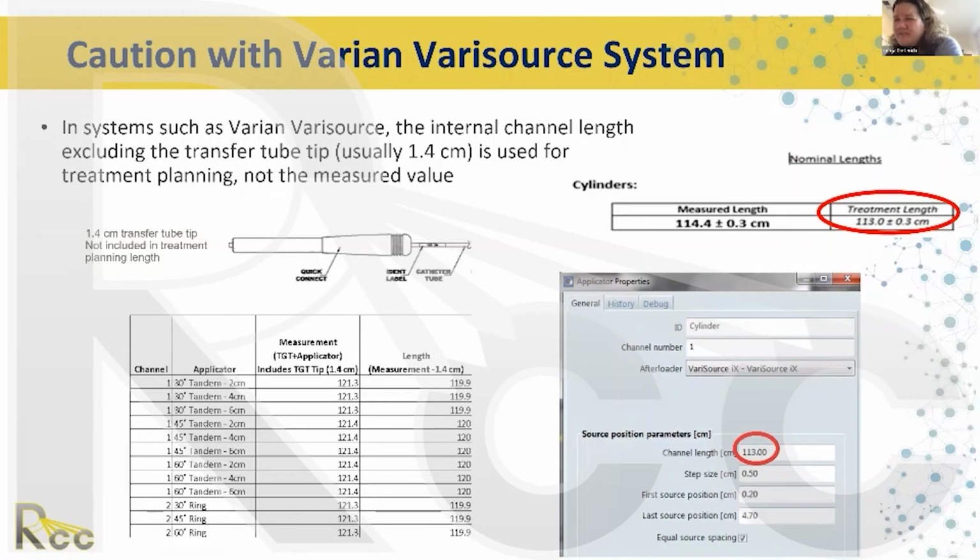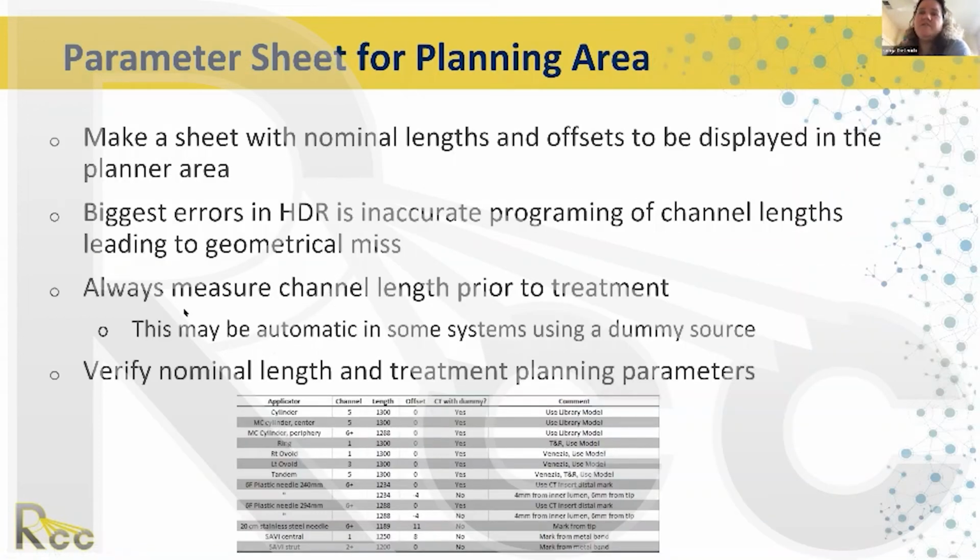It's been 12 years since I've worked on a Varisource. So yeah, make sure that you know the difference between measured and treatment planning system length. And that's explicitly specified in the instructions for use that the vendor gives you.